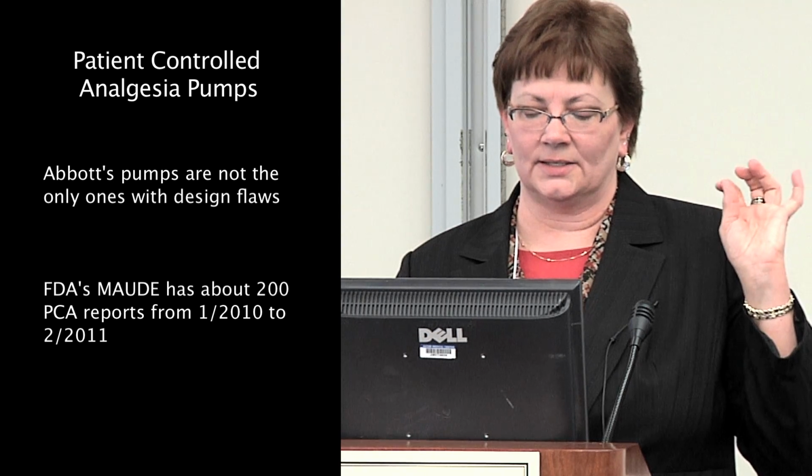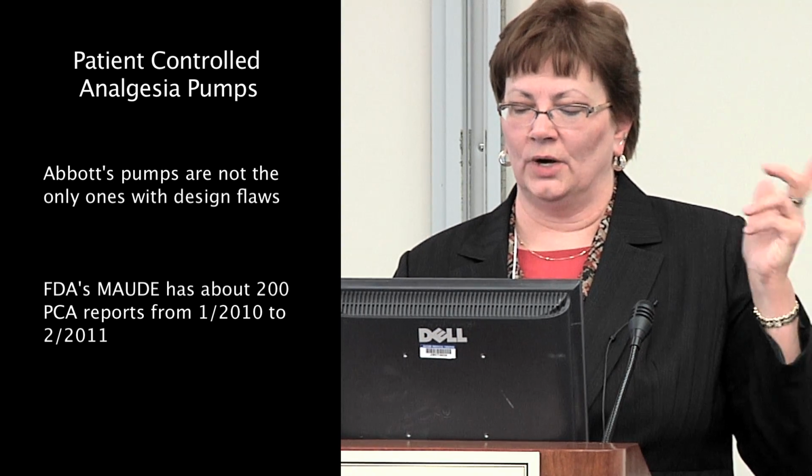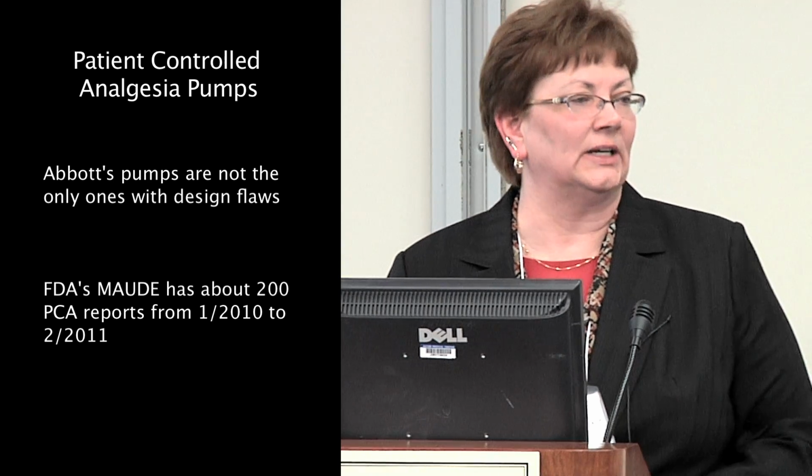I was shocked. When I looked at FDA's MAUDE database and typed in PCA, there were 200 reports for various different machines. And we just looked at this. We had a CADD pump. Some of the CADD pumps were in mLs per hour. Some of them were mLs per 24 hours. Nobody noticed. Purchasing did one of those, I got a better contract kind of thing. And when we finally sat down and looked at it, they weren't the same pump, and we wanted to standardize. So boom, spent the money, got brand new pumps. We replaced the ones that were non-standardized. But that's where I found a whole bunch of patient deaths. There's a lot of data in there, and it's experience from all over.